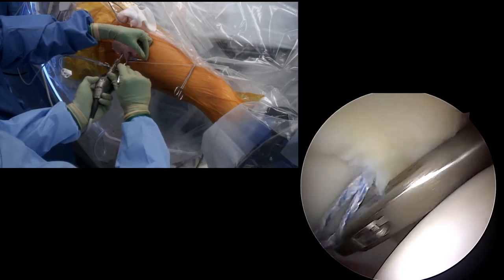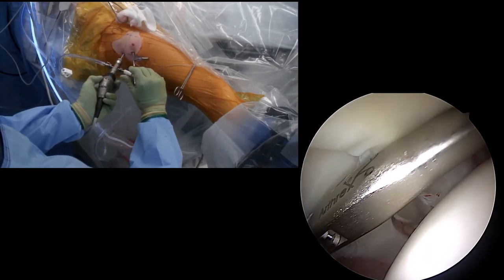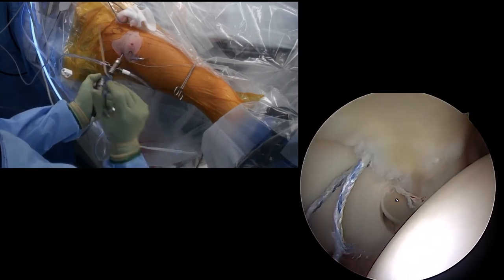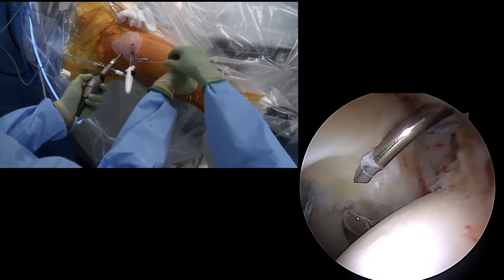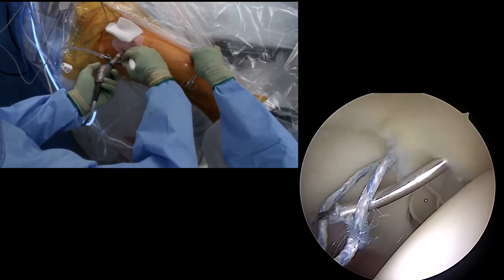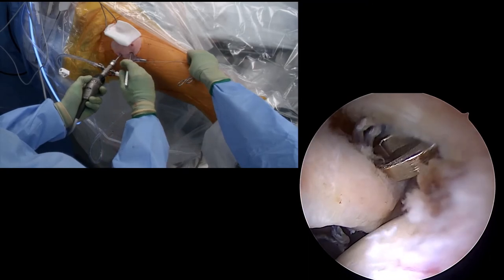A simple knotless repair suture would be taken around and around by simply pulling the suture all the way around the labrum. But in this case, since the labrum was very large, the decision was made to go for a knotless labral base refixation pattern. This is achieved by separately re-penetrating from the capsular side of the labrum through to the articular side with the small antegrade passing device — as shown in both the outside and inside views — while maintaining tension on the suture construct. The antegrade passer is brought through the labral base tissue through the mid aspect of the labrum, and then the suture is captured and re-delivered through the labrum again, going from its bony interface through the chondrolabral base tissue and back out the mid-substance of the labrum.